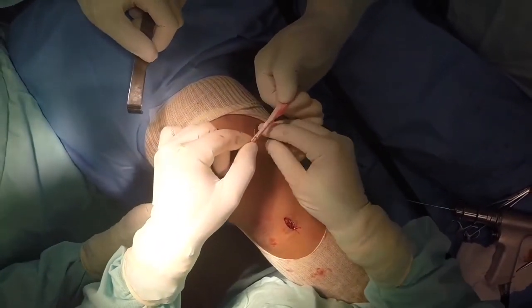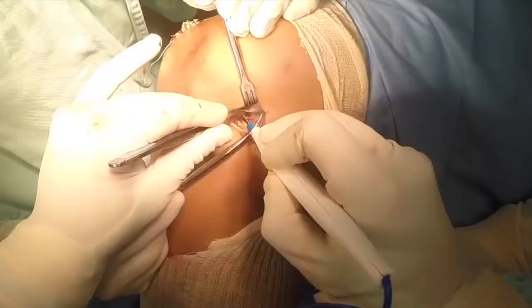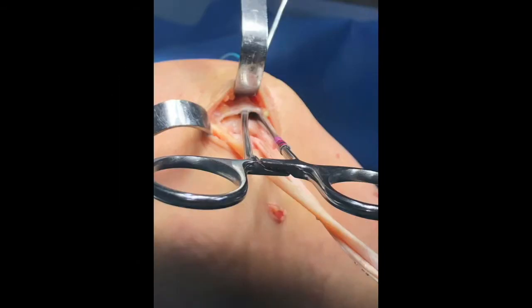A two centimetre incision is made between the adductor tubercle and the medial epicondyle. An eyelet guide wire is placed at Schöttle's point using fluoroscopy and drilled bicortically, then over-reamed to a depth of five centimetres according to graft diameter, which is typically seven millimetres.